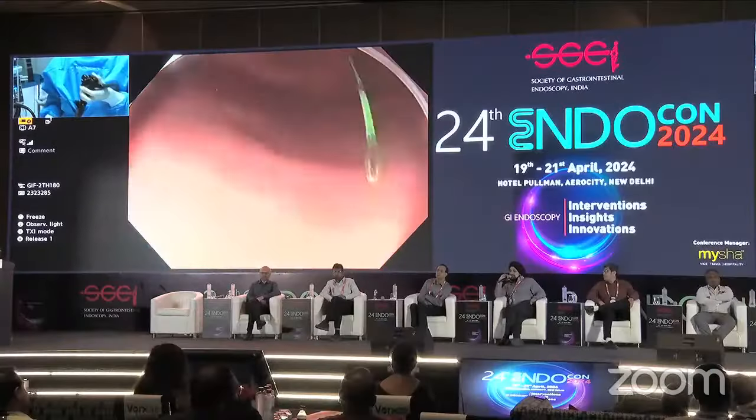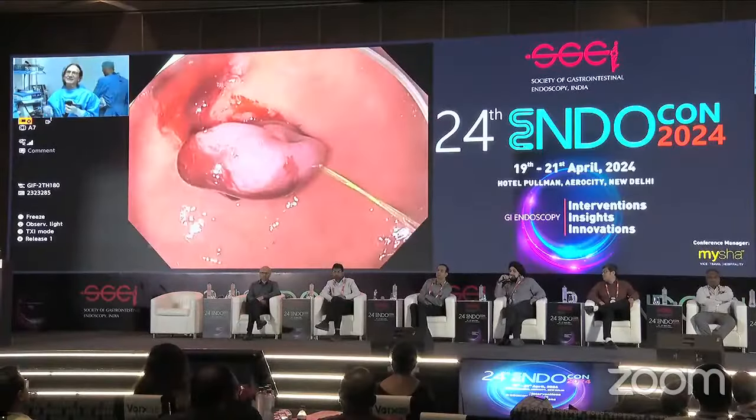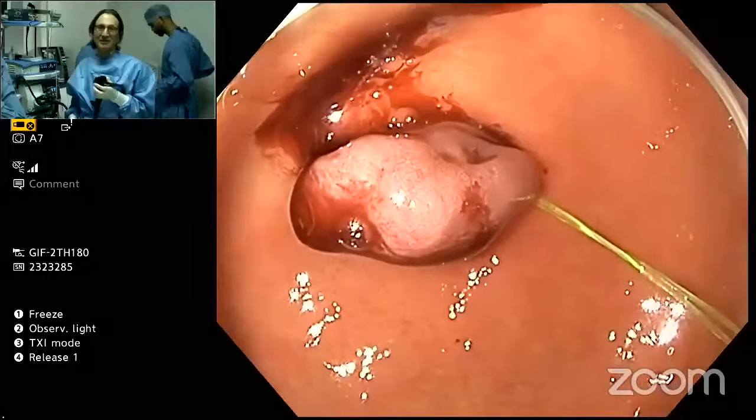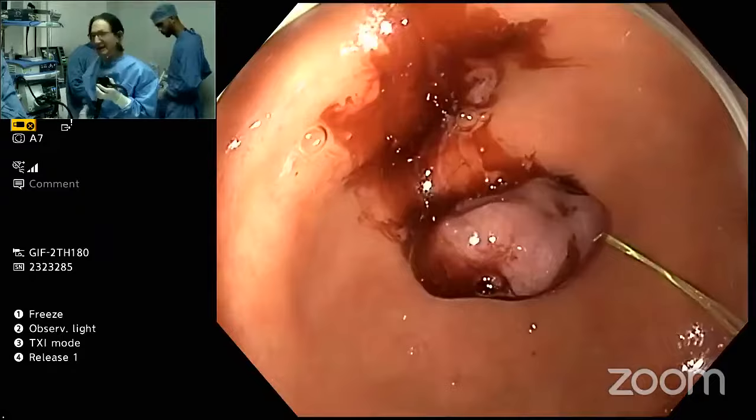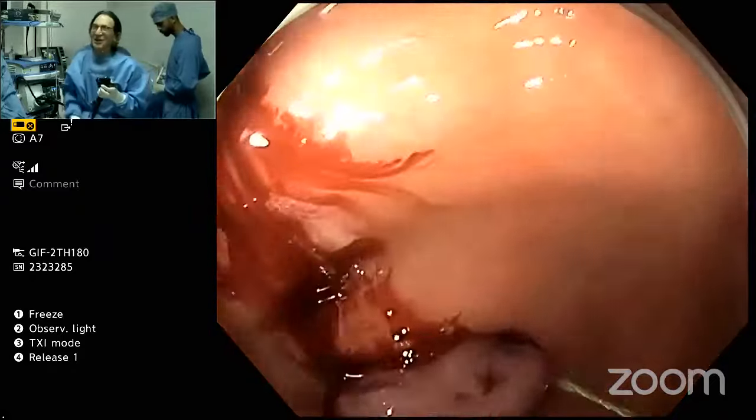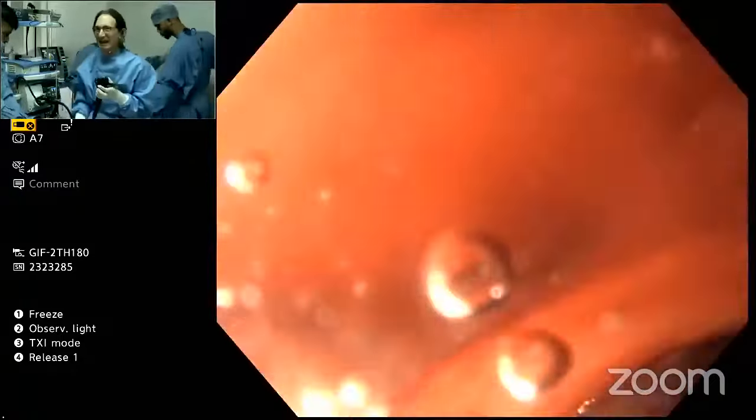Dr. Binmoeller, does this come like this, or is it some sort of homemade arrangement which we did, the putting of the loop onto a snare? Is it something which comes pre-made? Yes, it's pre-made. I didn't make this beforehand. It's already manufactured. Yes. Can I have some water, please? There we go.